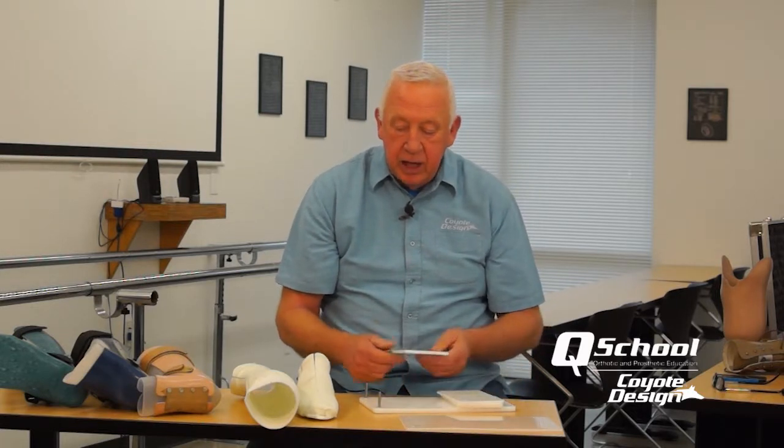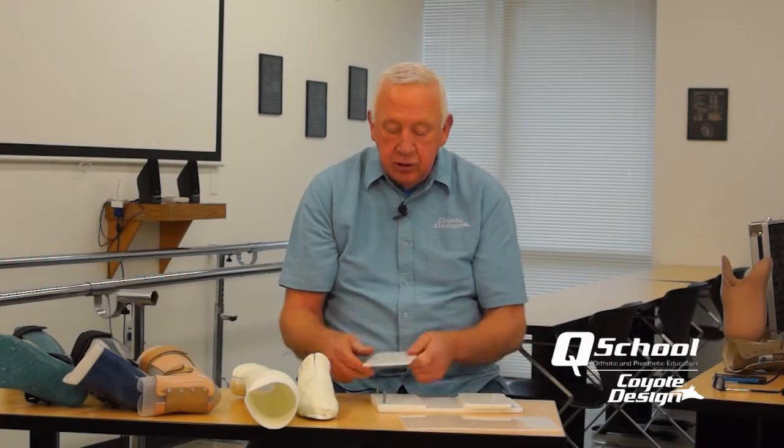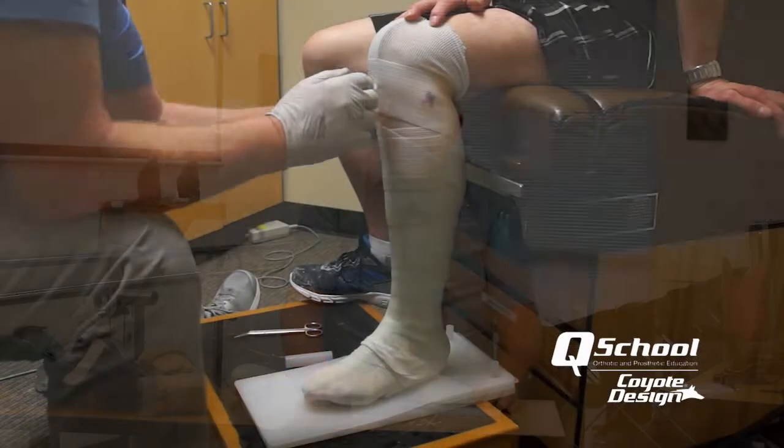To wear a shoe with an AFO you're typically taking out that insole pad and fitting the AFO inside to give a little extra depth in the shoe. So we'll set this up for a three-eighths inch heel height with a quarter inch plate and an eighth inch plate, plus a top plate of a more flexible plastic. That's set up in place and we cast in a seated position.